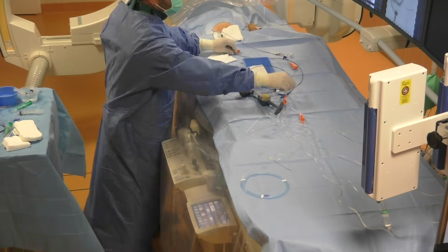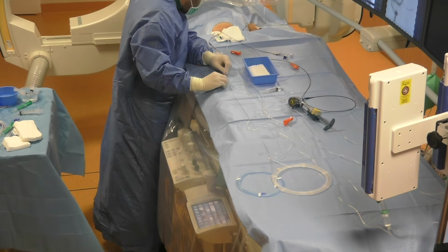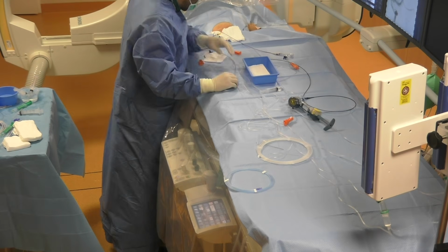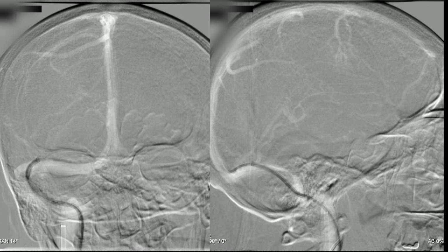And this is the Neuroslider 52. We can push it with the Terumo wire through the Neuron MAX long sheath into the superior sagittal sinus. And here we have the CARESTO Heal stent, which is very similar to a flow diverter. After reaching the implantation zone, we can pull back the Neuroslider delivery catheter to start the implantation.